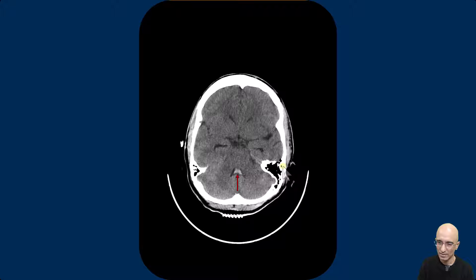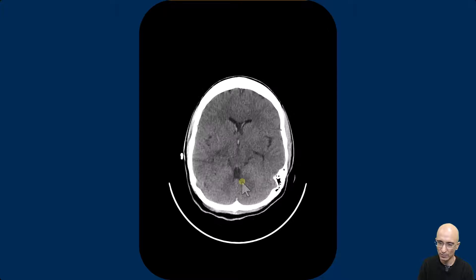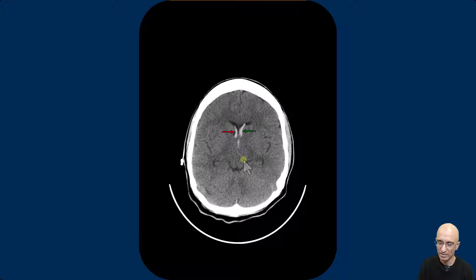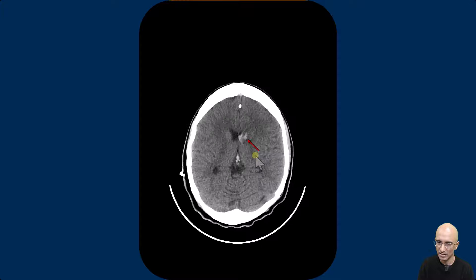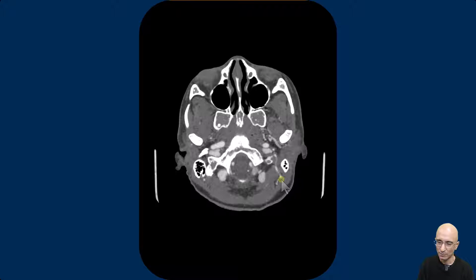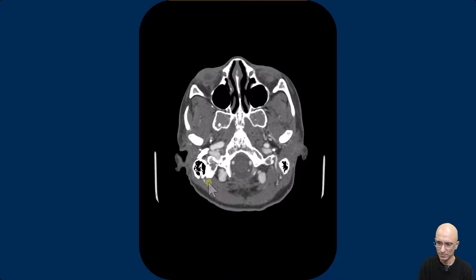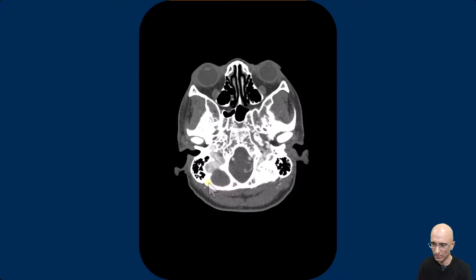Patient represented few years later with headache and CT head examination was performed. You can see hemorrhage in the fourth ventricle, the ventricles are mildly dilated, you can see hemorrhage in the lateral ventricles and third ventricle, and also hemorrhage in the caudate head. As part of workup, patient subsequently underwent CT angiogram examination to find the source of hemorrhage.